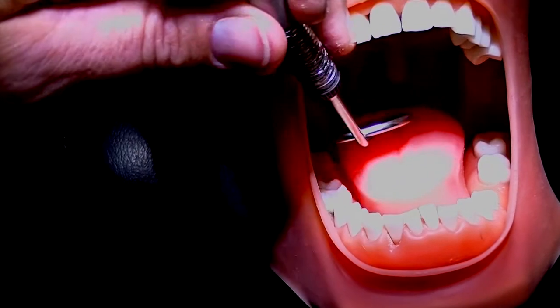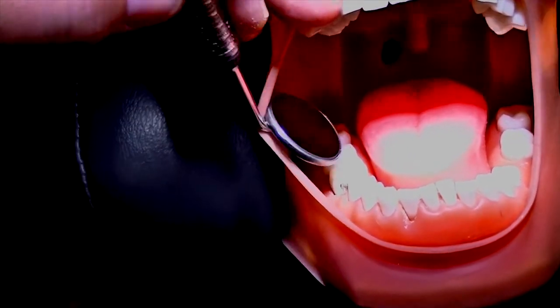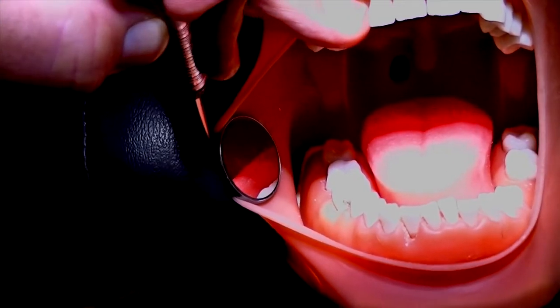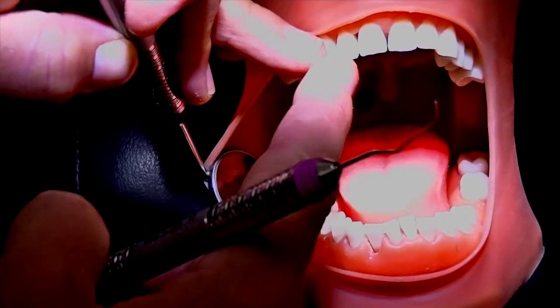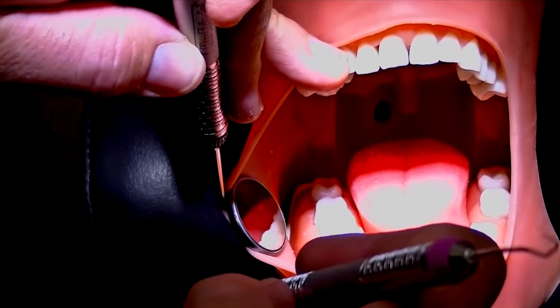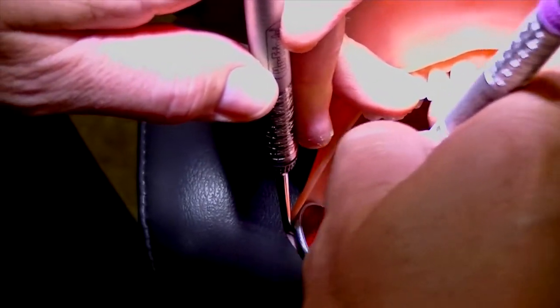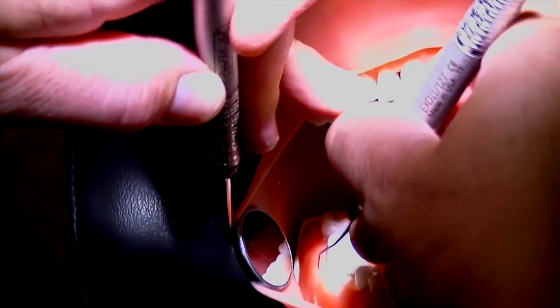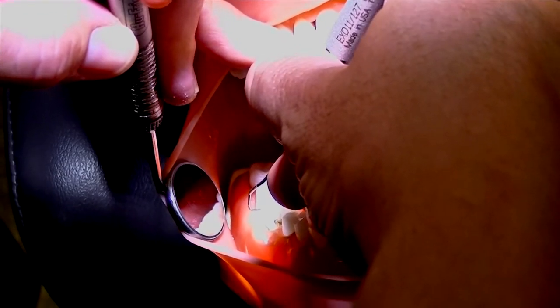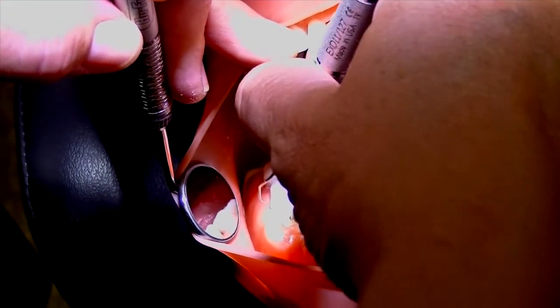So the fourth quadrant buccal posteriors, 8 o'clock position, 8:30. Head is straight, mirror fulcrum on the first quadrant anterior facial area, somewhere in there. And your instrument fulcrum is around the fourth quadrant, again on the incisal occlusal surface. And you'll notice when you have your hand in the mouth that your hand is going to be right close to the top teeth, if not touching.